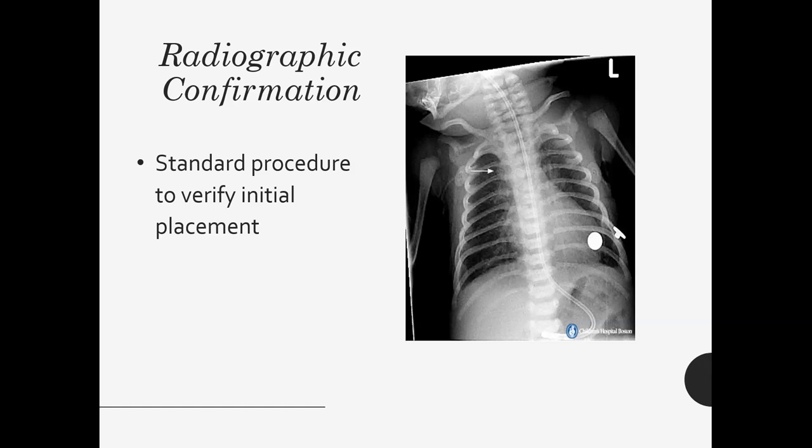So this is standard procedure to verify initial placement. So you can see here, you can see the NG tube going down and in, it looks like it's into the stomach, okay?